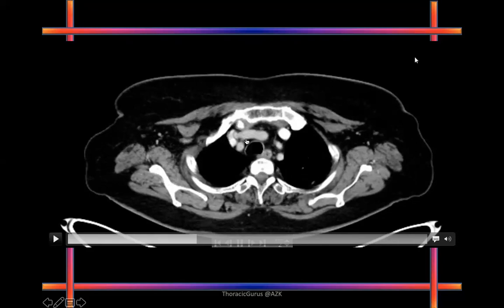If there is a lymph node here, Pithun, if there's a rounded structure and if there's a lymph node, what will it be? So that will be the prevascular, right? No, prevascular is. No, meaning, what is this structure? That's the trachea. And what is the lymph node in this area? Okay, so that will be 2R. Right paratracheal. Yes, it's right paratracheal. Very, very easy to understand.